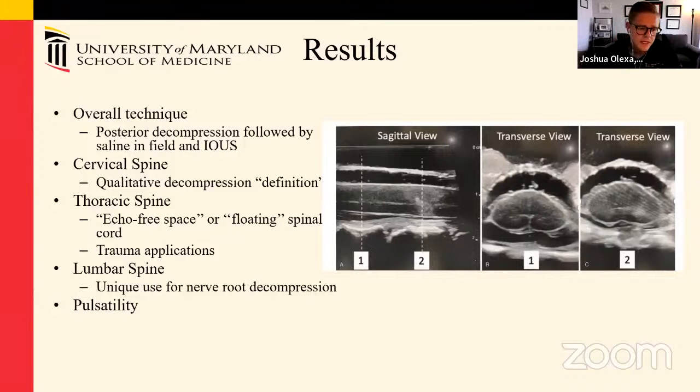When looking at the lumbar spine, this was actually the least studied area in intraoperative ultrasound, and the one I would posit may have the best area for improvement in that foray.